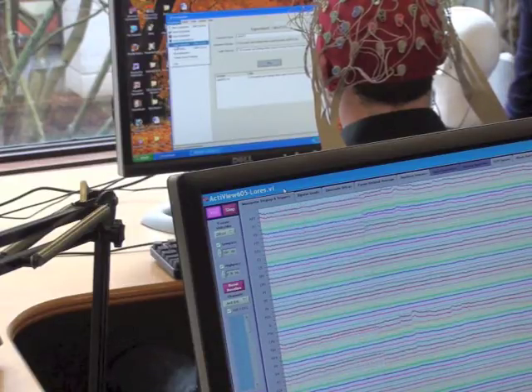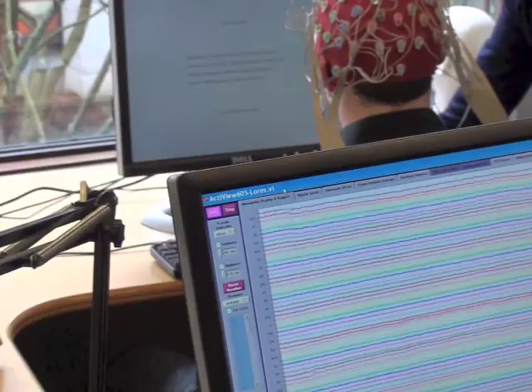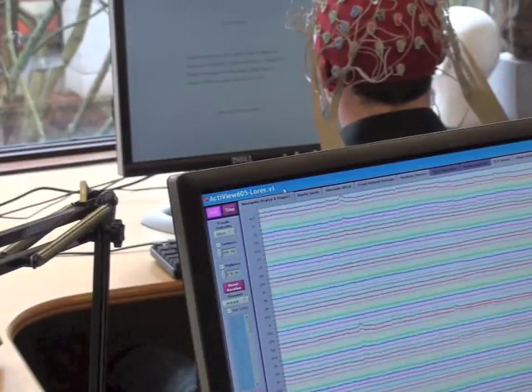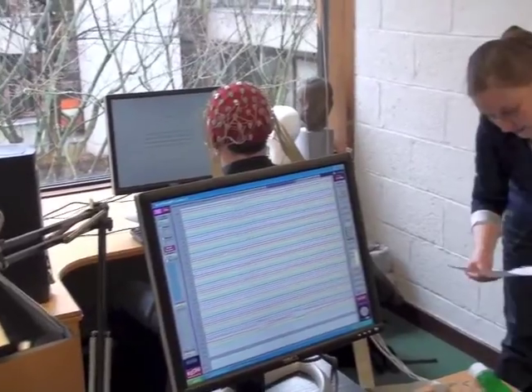I'm going to run the experiment and then explain a bit more. You enter in the subject ID and run the experiment. At this stage, when I have it ready to go, I would make sure the lights are off, the lamp is on, everything's done, I'm ready to record. I'm just going to check in case there's anything I've forgotten before I do this.